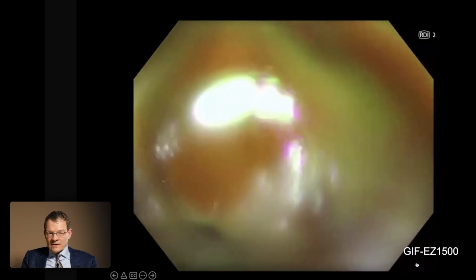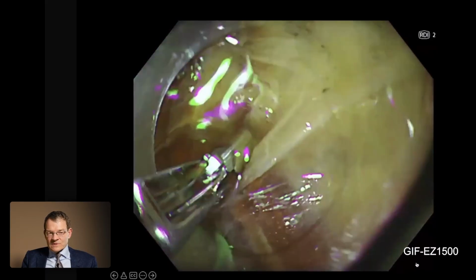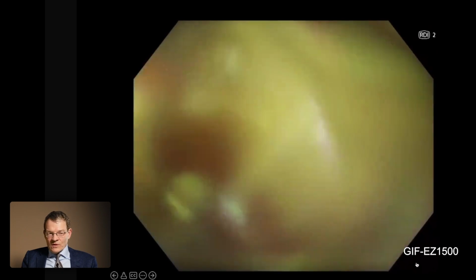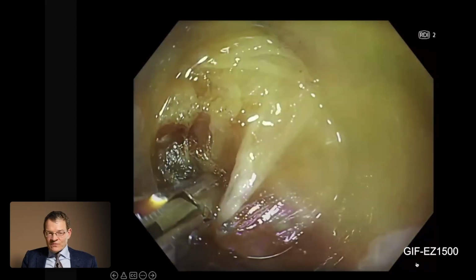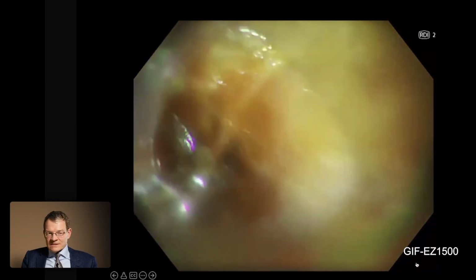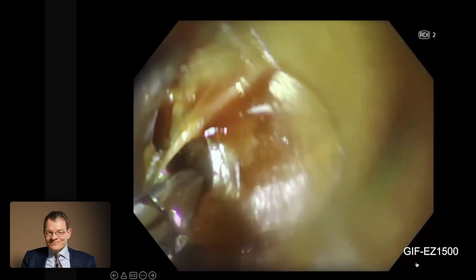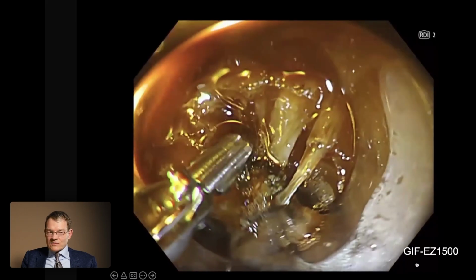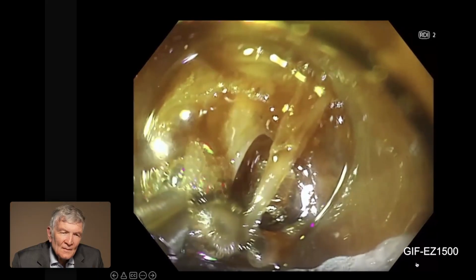And yes, now you can precisely place your coagulation forceps, and you can start to coagulate this vessel. Here in this case, it's not done with only one coagulation. I think there were several arterial vessels. So finally, even after the first coagulation, there was still bleeding, but here you may nicely appreciate that you can control this situation. And I have to admit that I would say this is definitely a good feature for such critical situations.